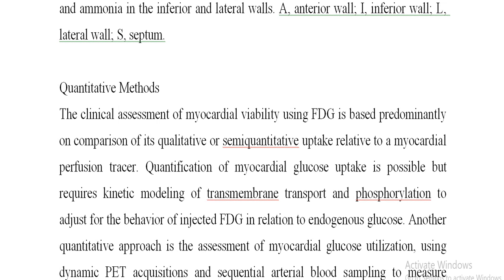Flow can be measured at rest and after pharmacological vasodilation to determine the myocardial blood flow reserve, the ratio of maximal flow to resting flow. This coronary flow reserve has been used in the assessment of stenosis severity, flow limitation in CAD, as well as the evaluation of changes in flow after medical treatment of CAD risk factors such as hyperlipidemia, DM, and smoking.